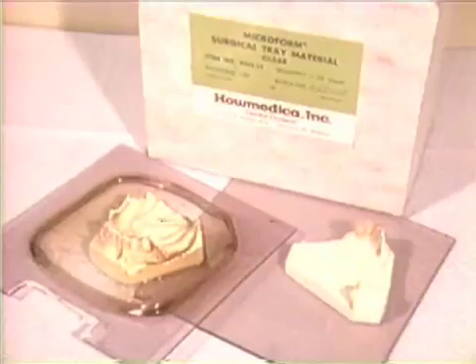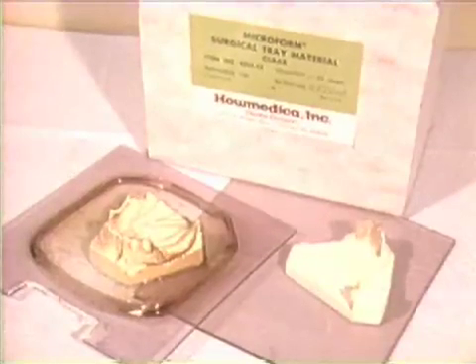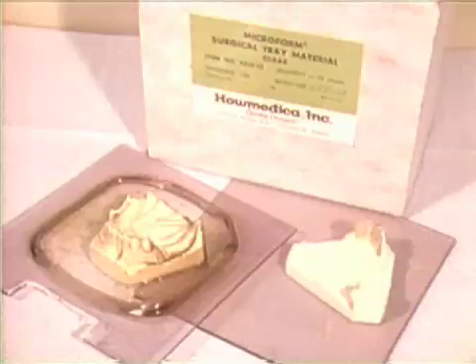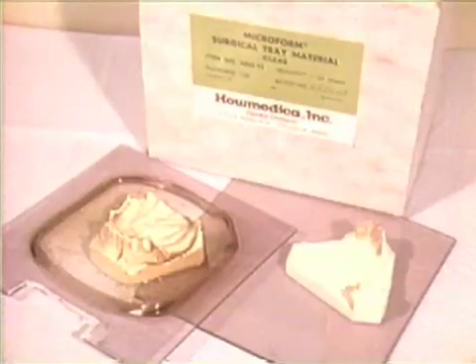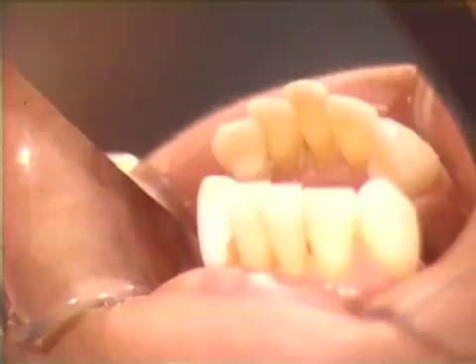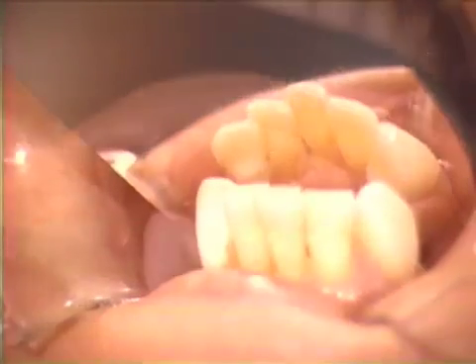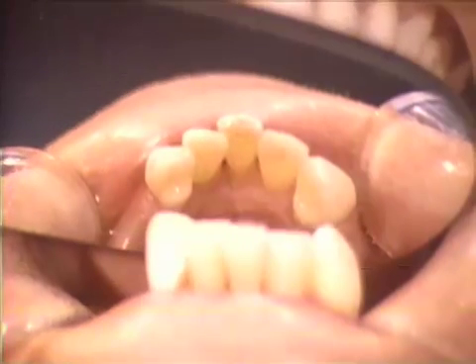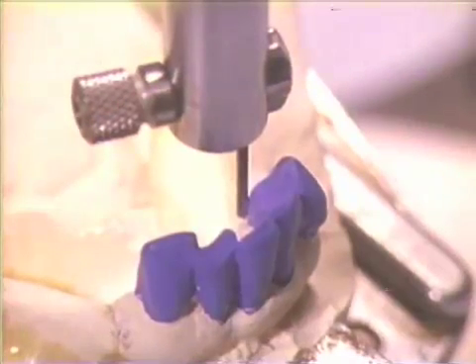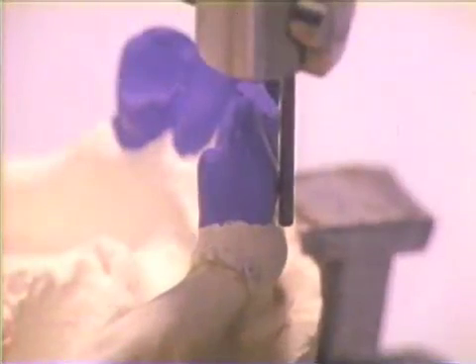This waxed cast is then duplicated in a suitable gypsum such as Yellowstone. A transparent and relatively thick thermoplastic sheet is then heated and vacuum formed over the duplicated cast to create a matrix of the desired tooth shapes. After lubricating the interior of the matrix, restorative material is placed in the lubricated matrix and applied over the appropriately conditioned teeth. Materials placed by this method require only minimal finishing. A cast of the recontoured teeth shows the newly established lingual guiding surfaces, facial undercuts, and cingulum rests.